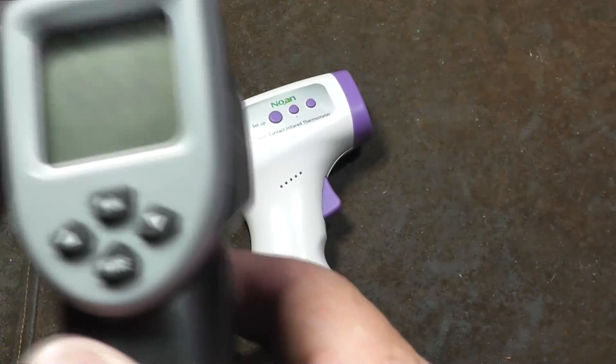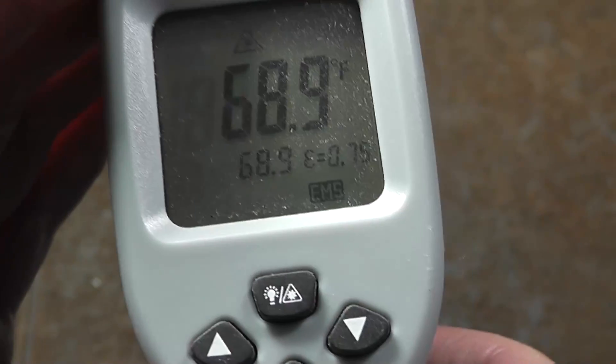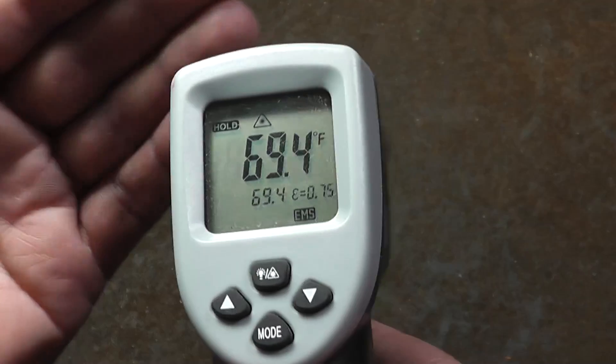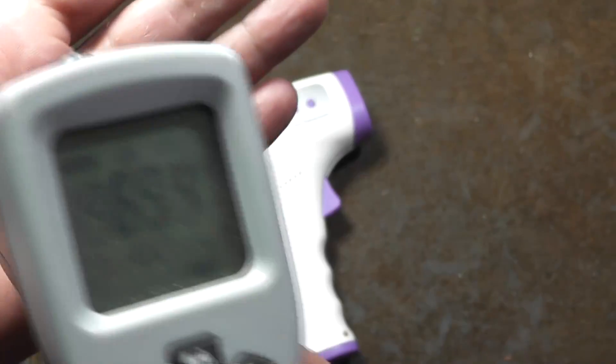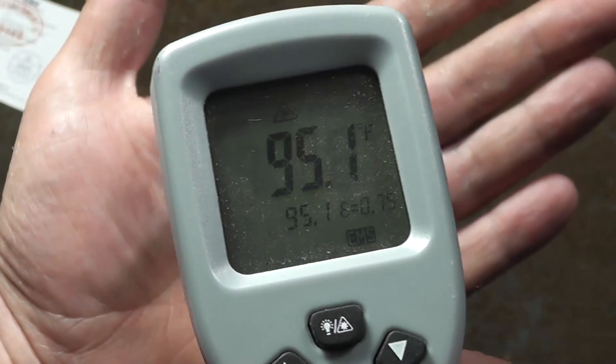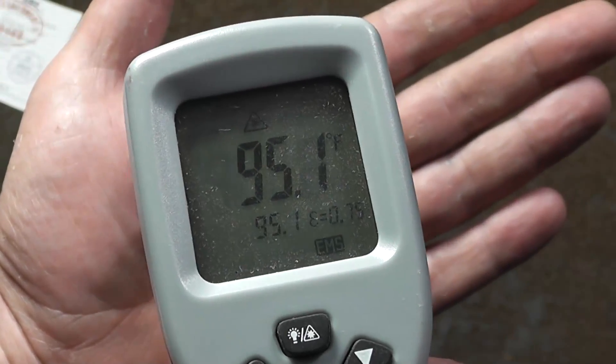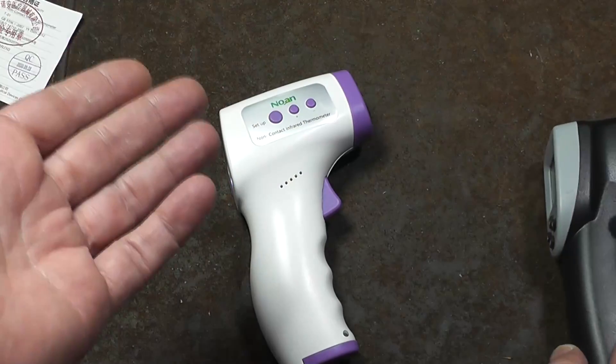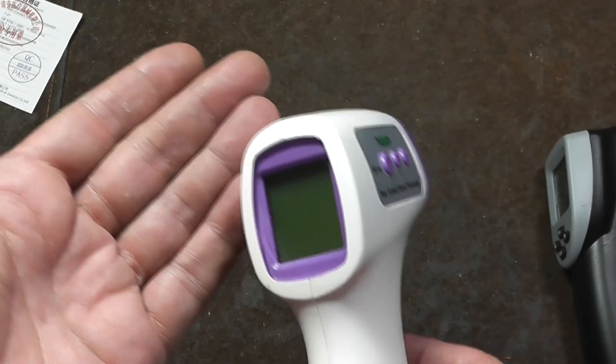And these are definitely not reliable enough. Even nicer ones like this, which have what's known as an emissivity setting — which is a dynamic calibration that you can adjust because different materials reflect different amounts of heat — I have this one adjusted, and it does okay, but it's going to vary by a couple to three degrees, which is the difference between saying somebody is fine or saying somebody has a fever.